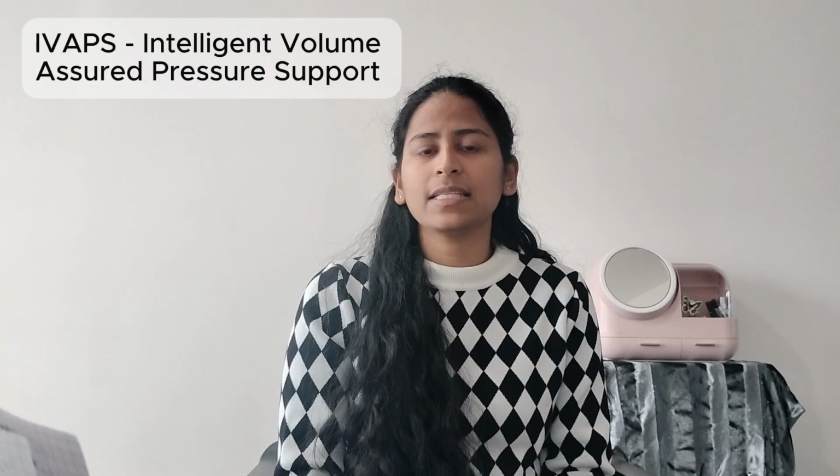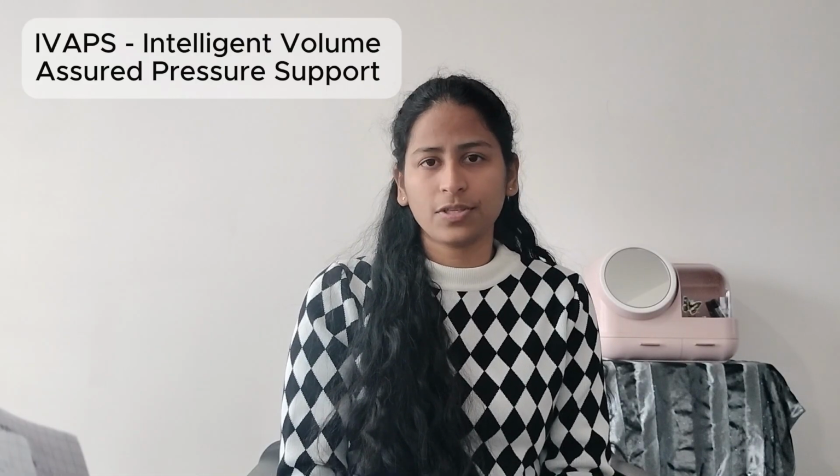Our particular patient was on an IVAPS setting. IVAPS is Intelligent Volume Assured Pressure Support. It's a nice name in the sense that it is intelligent, kind of like an AI-generated tool, and volume assured, meaning that alveolar ventilation is the key component, which is targeted. It has both IPAP and EPAP settings. EPAP is the baseline pressure, which keeps the alveoli open, and for IPAP you have minimum pressure support and maximum pressure support, which would vary to achieve your ventilation.